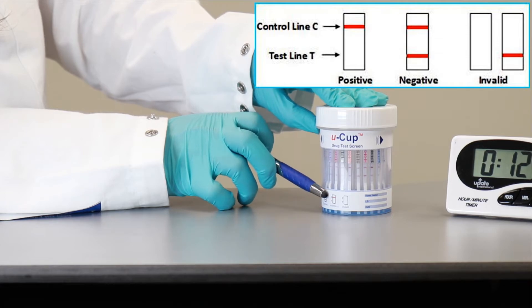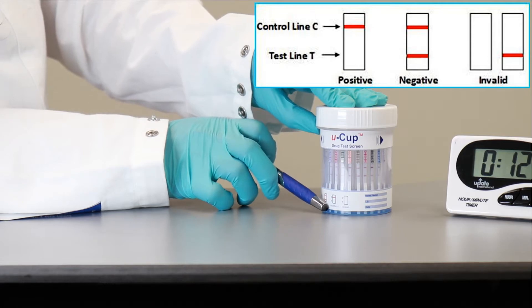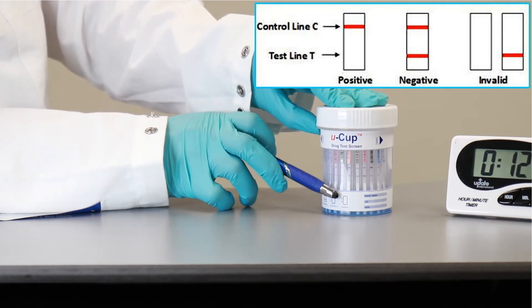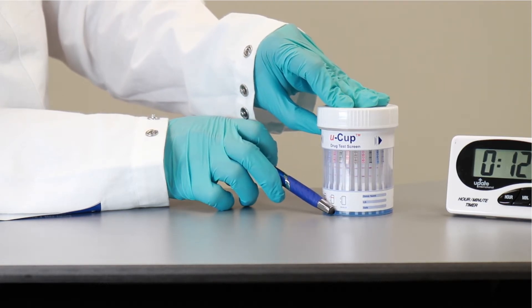If there is only one line, which is a control line, and no test line, the result is positive. If you do not see any line, there is a blank window, that is an invalid result.